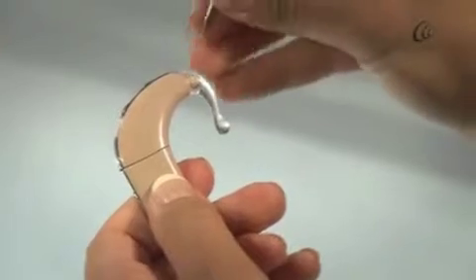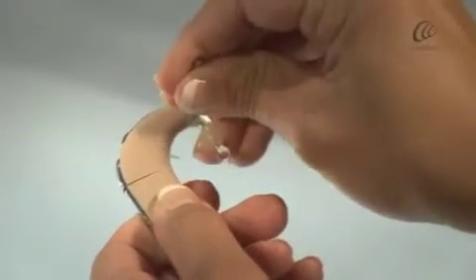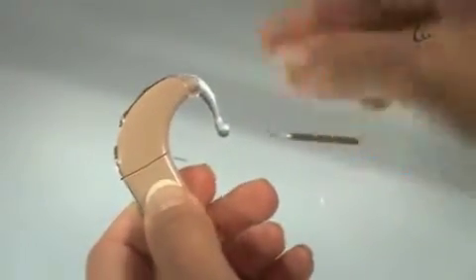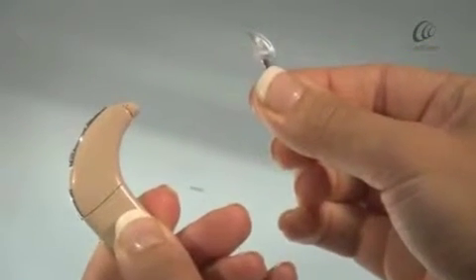To remove the earhook, gently insert the pointed end of the tool into the hole. The pin will fall out. Push the earhook downwards to remove.